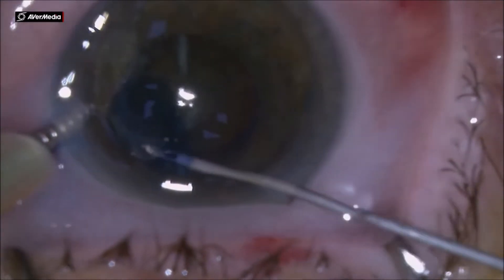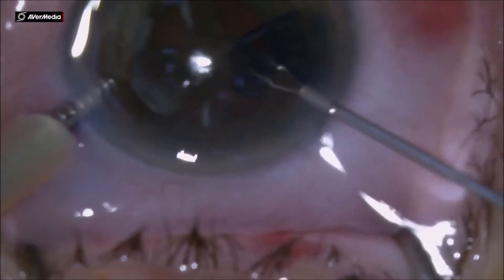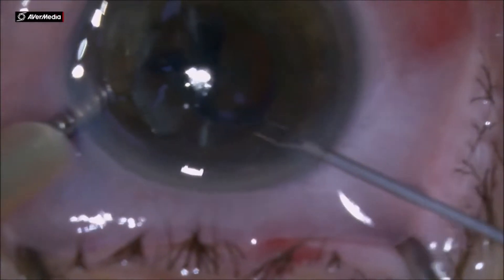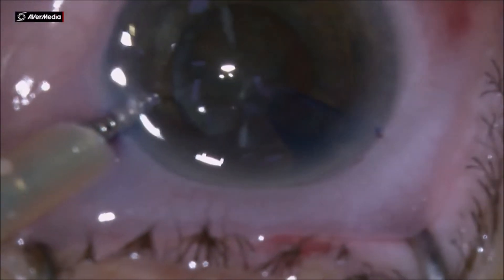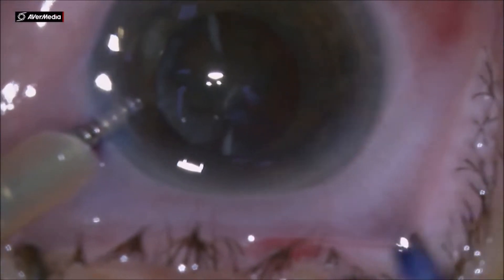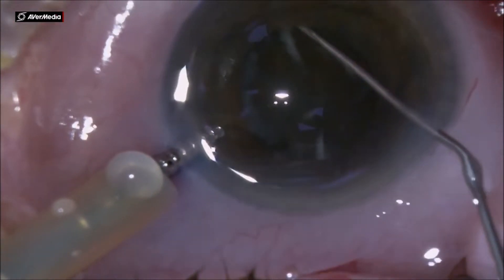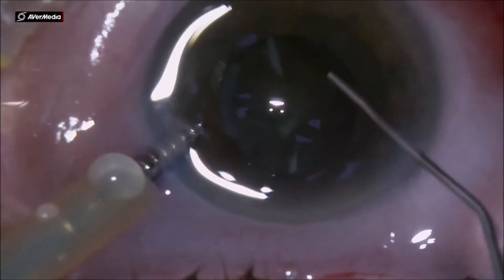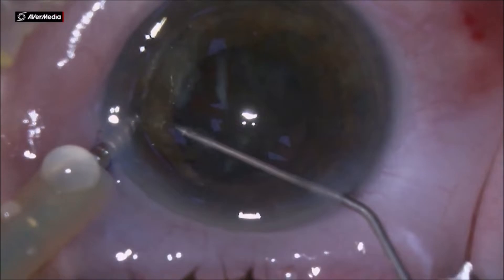That's very important especially in floppy iris syndrome patients. When you have a pupil that's not very well dilated, it's always good to develop your skills to be able to do the capsulorrhexis under the iris — to have a capsulorrhexis larger than the pupil.